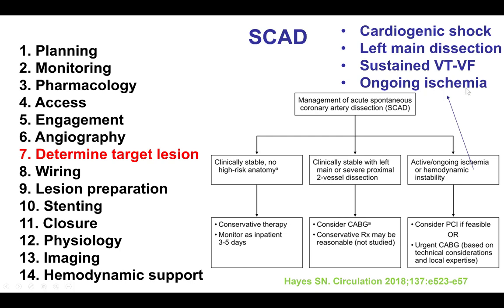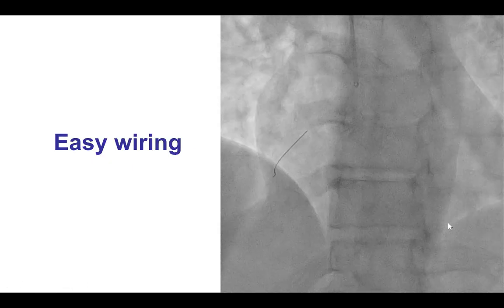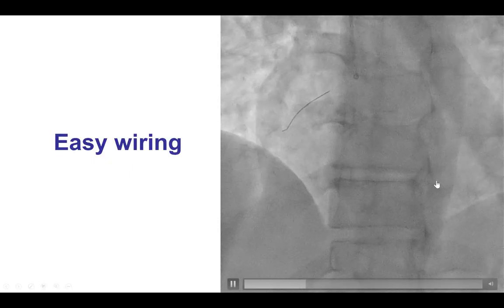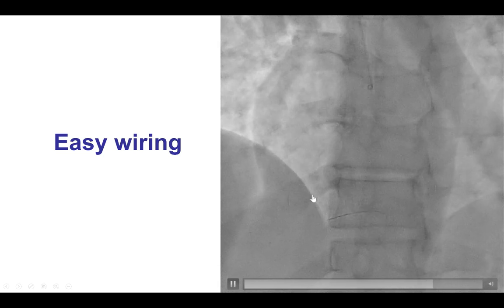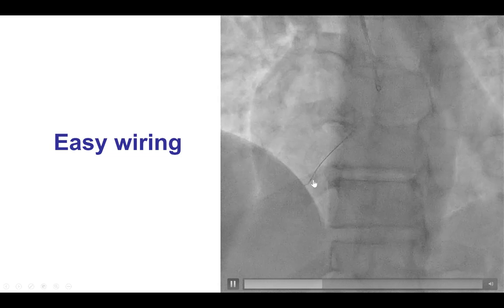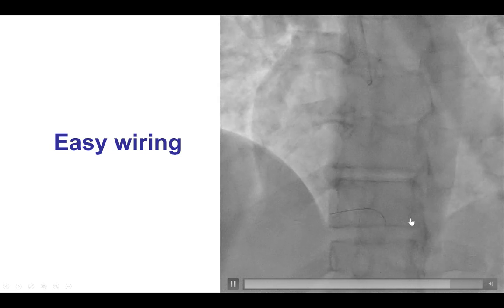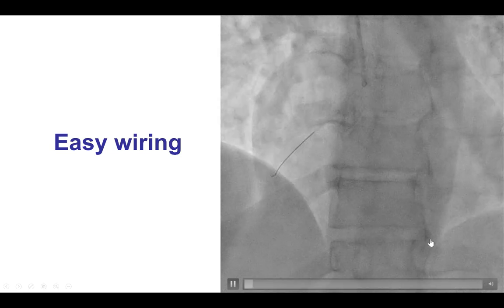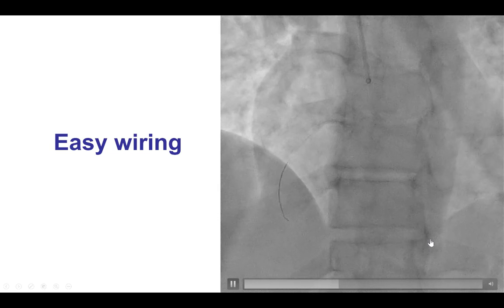Our patient was having ongoing chest discomfort. Therefore, PCI was chosen as the modality of revascularization. In such cases, wiring should be done with caution to prevent extending the dissection using a workhorse guide wire. Fortunately, the wire easily advanced to the end of the PDA.